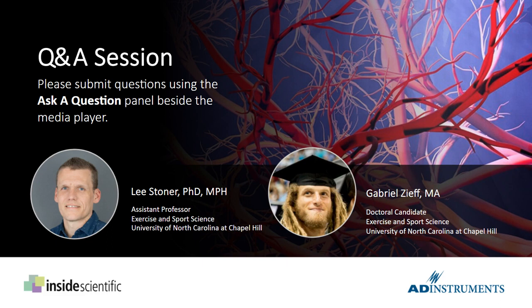So, and there's no easy way of making adjustments for that. So that is going to give us a slightly different measurement as well. Right. Okay. Because that PPG measurement is normalized to the R peak in the ECG. Yeah, we're going from the R peak to the foot of the flow wave rather than from a foot of a flow wave to a foot of a flow wave. Right. So there's an extra source of variability in there. Mm-hmm. That makes sense. Cool.